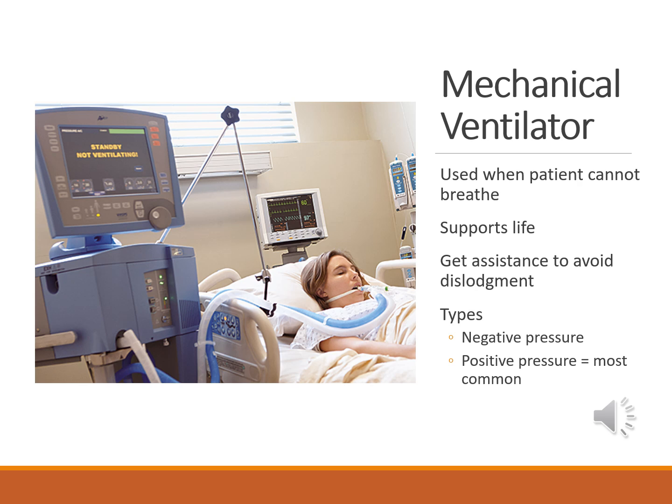You want to use strict hygiene practice and gloves if there's a risk of contact with blood or body fluids. If there's a problem with the ventilator, an alarm will sound. This could signal a serious issue that needs urgent attention. Patients on positive pressure ventilators can't communicate well because of the ET tube or tracheostomy. In order to help reduce frustration, explain what will happen and provide a way for them to give you written feedback.